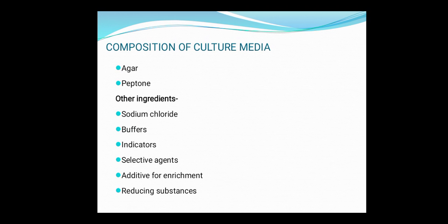So agar and peptone are the essential or most important components of the culture media besides other ingredients. Other common ingredients of culture media include sodium chloride, buffers, indicators, selective agents, additives for enrichment, and reducing substances.